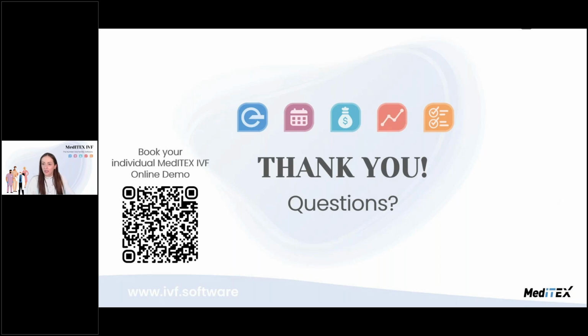How would you think a clinic would adapt to a change in systems? Would it be easy to switch to MedITEX? Good question. So we are very experienced when it comes to historical data import. We also work with REST API, for example, which is a very flexible interface. So if you're using several different systems at the moment, we can integrate and communicate with them through our REST API interface.